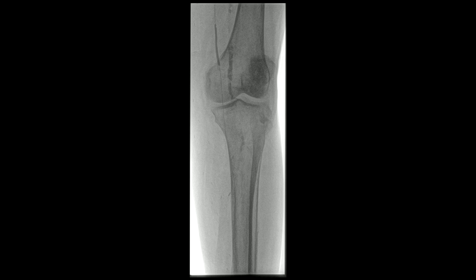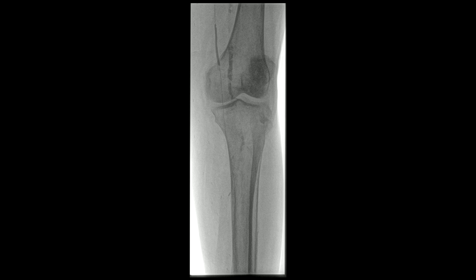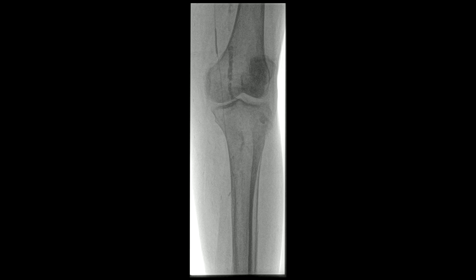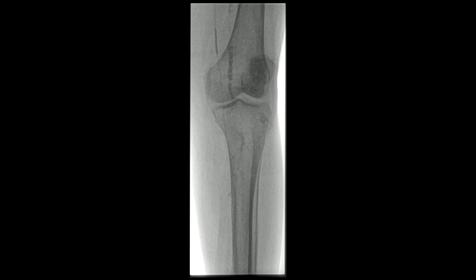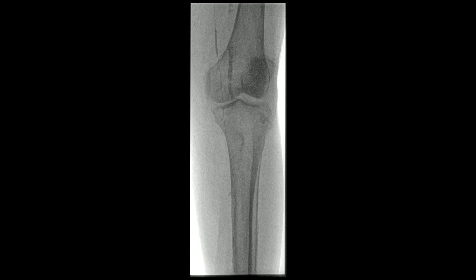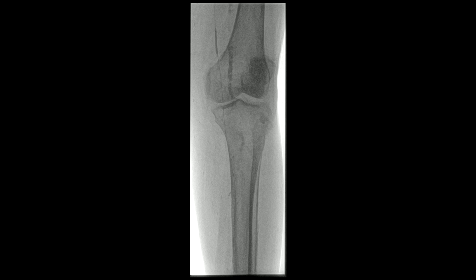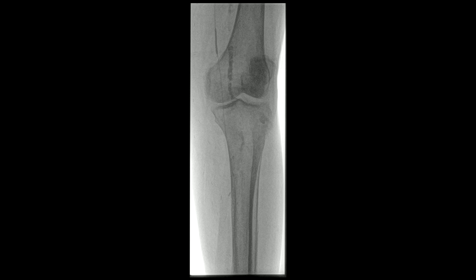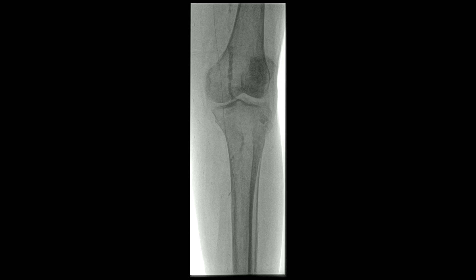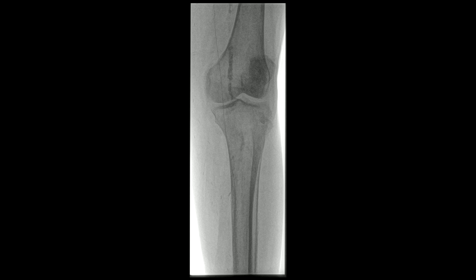We use a drug-eluting balloon in this situation. When you inflate it, you need to dwell for usually a couple of minutes to allow the drug to be delivered. We then take it down and re-inject to see whether we've resolved the stenosis — you expect a pretty good result in a situation like this. You can see it's almost completely resolved.